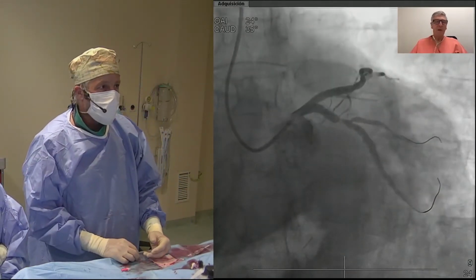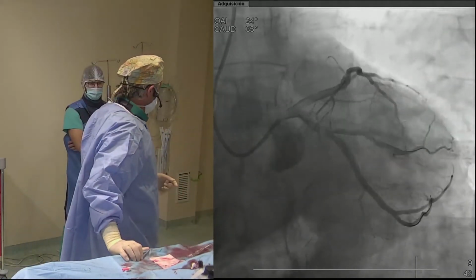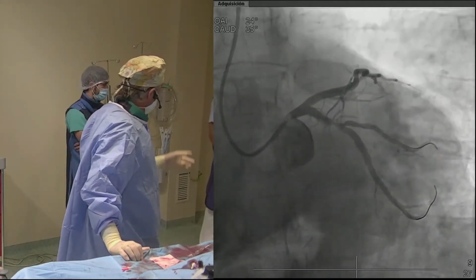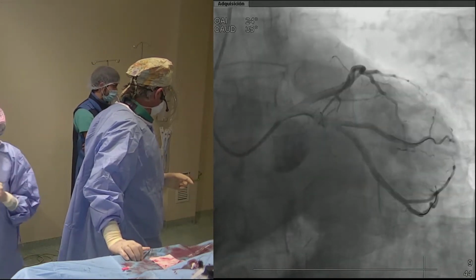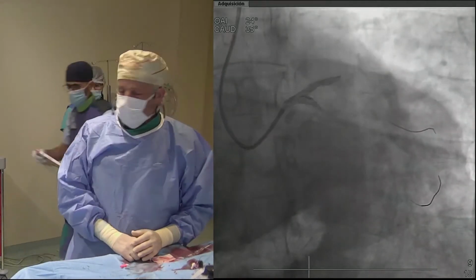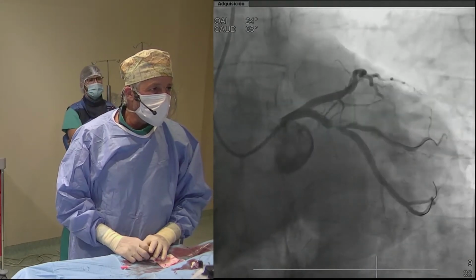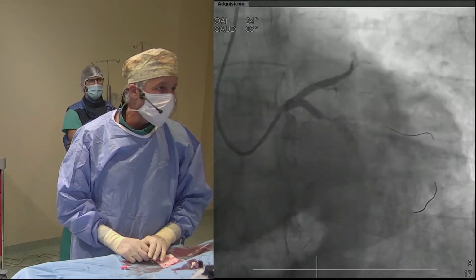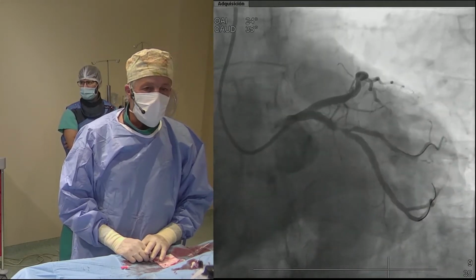Yes, we agree with Thierry. We are going to approach with a provisional stent, which is the most common approach. And because of the very tight lesion, we're going to pre-dilate. We have to use a Ryujin balloon, a semi-compliant balloon. Please give me a 3 millimeter, 320 Ryujin. Okay. We're going to pre-dilate with a 320 to start with. I hope we are going to cross, despite the severity of the lesion. There is no calcium.